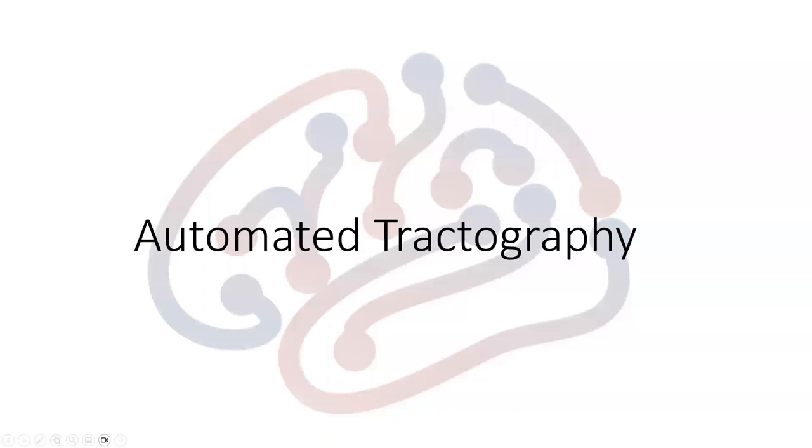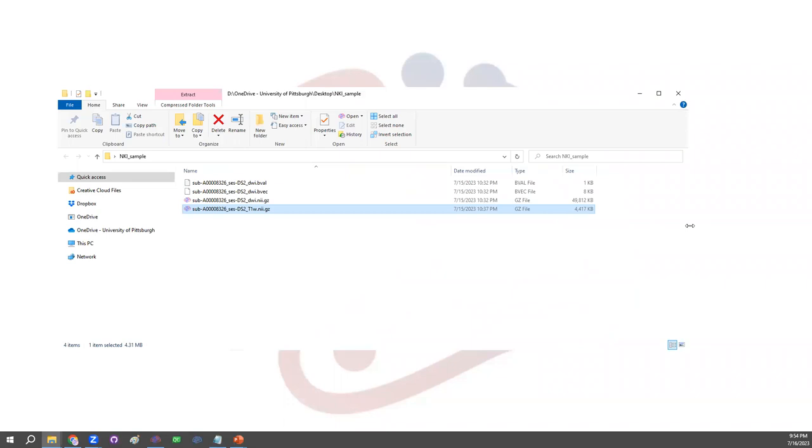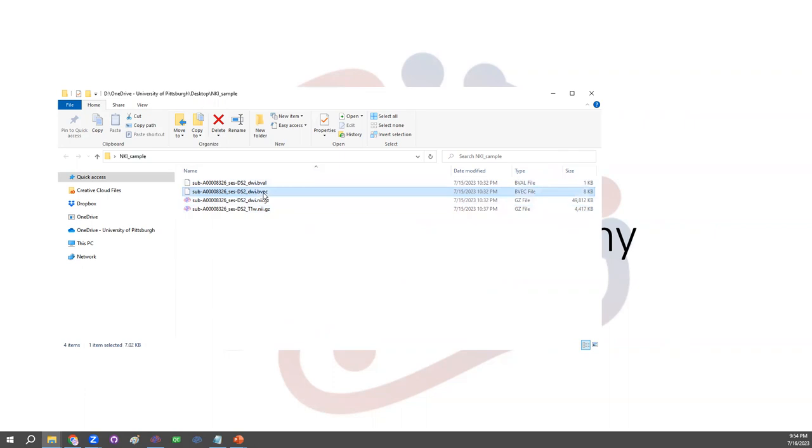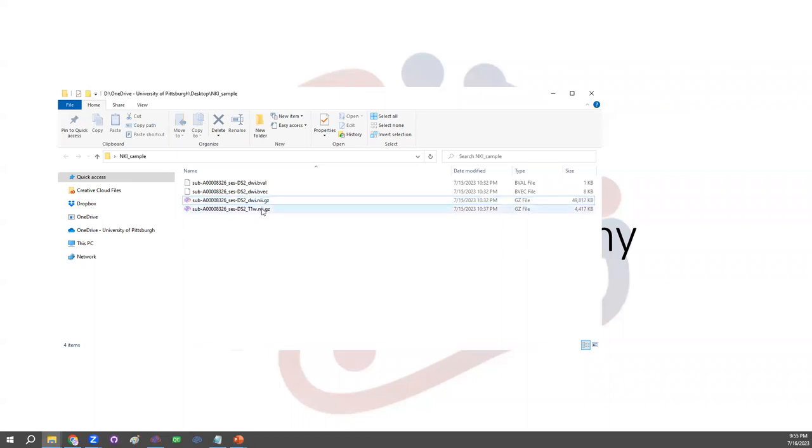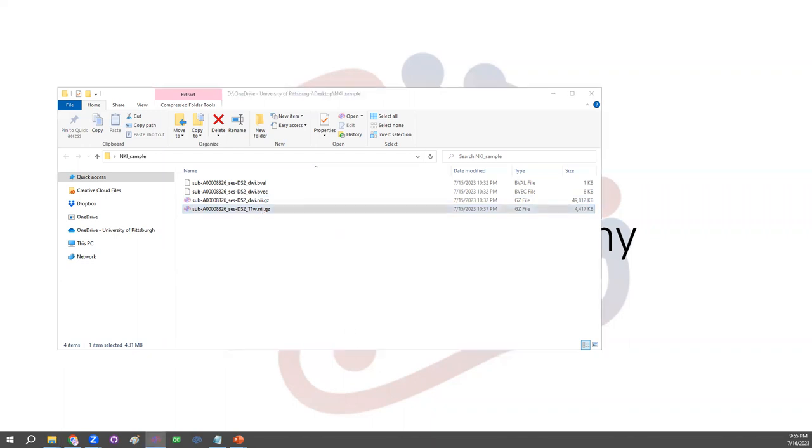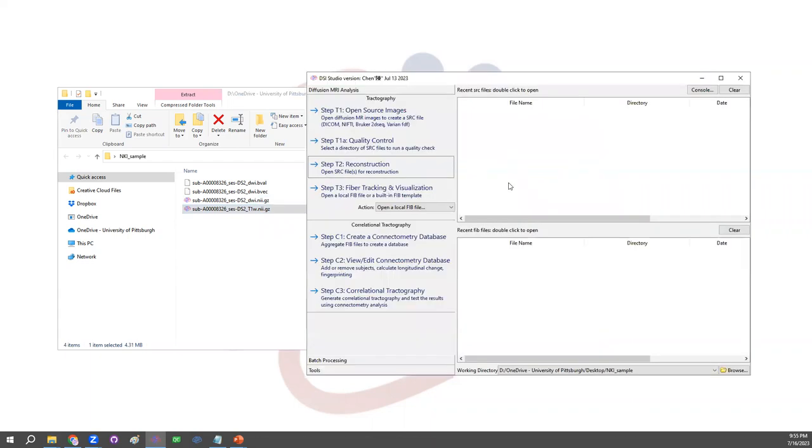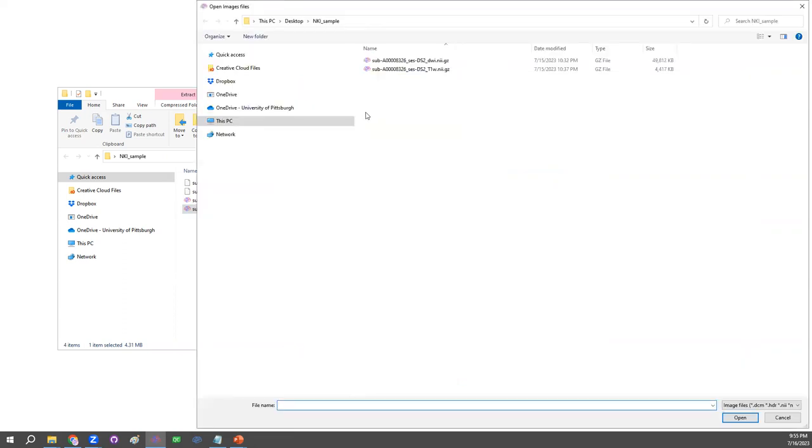So let's see how to do this in DSI Studio. The data we're going to use today is openly available. It's called the NKI sample data. You could download it from Open Neuro website. The data includes b-value, b-vector, and the Nifty file of the DWI data. There are also T1-weighted images available. This one is optional, but would be good for us to get an anatomical landmark. So start DSI Studio. The functions we are going to use are within the Tractography tab. We'll go through the first step, parsing the Nifty file, and run reconstruction, and then run fiber tracking.